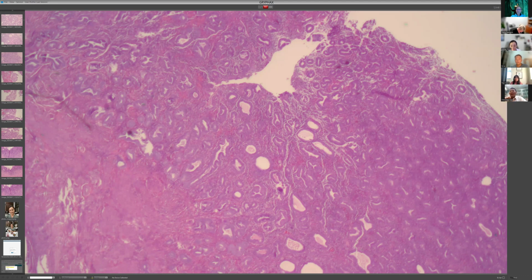No, atypical hyperplasia is one, and another two are without atypia. How to differentiate about gland and the stroma? So let me confirm your question: how to differentiate hyperplasia and atypical hyperplasia?